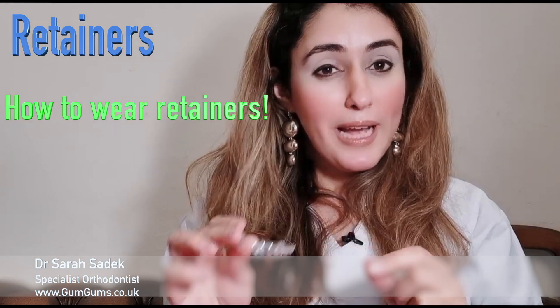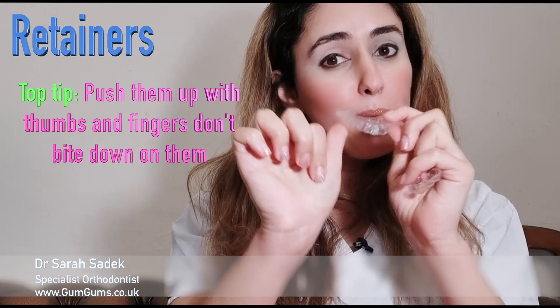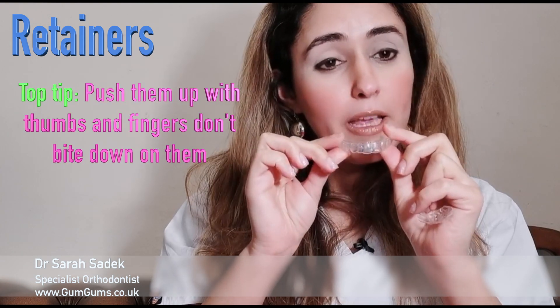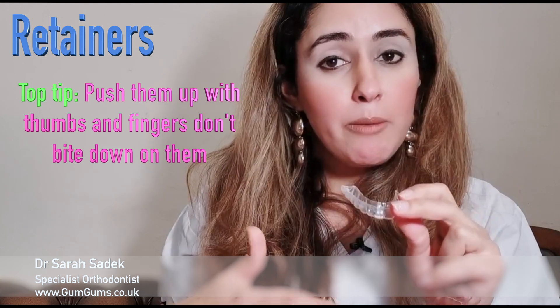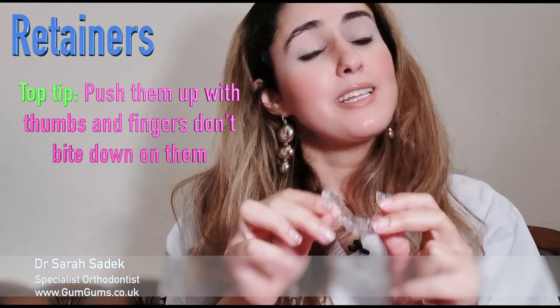I'm going to show you how to wear the retainers. Essentially, you're going to put them in and push them up with your fingers. This is the most important thing to remember when putting them in — what you don't want to do is bite down on them, as this can actually break the retainers.